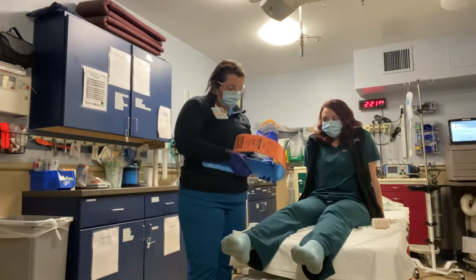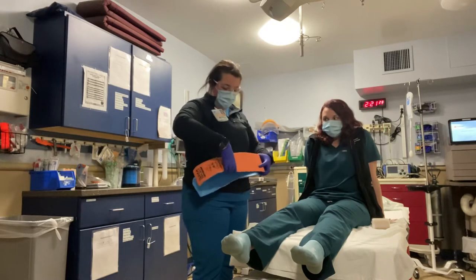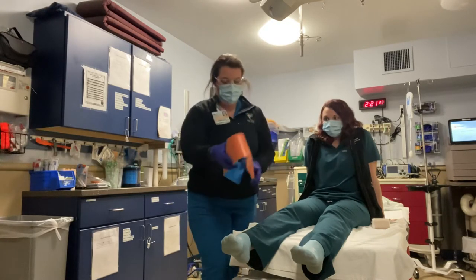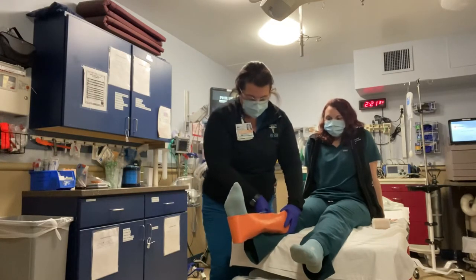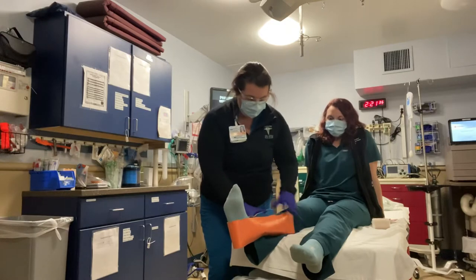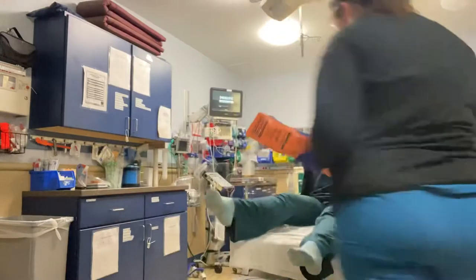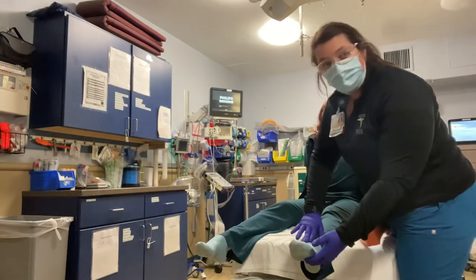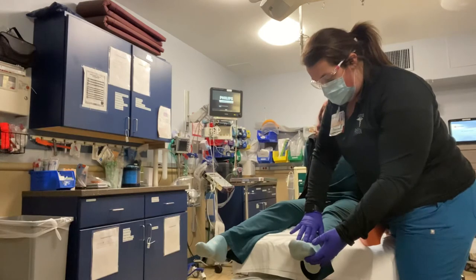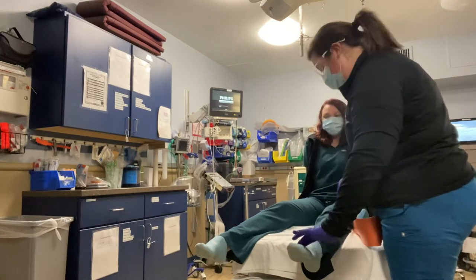I'm going to create a fold. I'm going to check her pulse. Can you feel me touching? Mm-hmm.